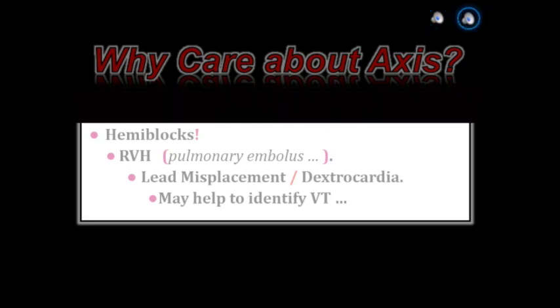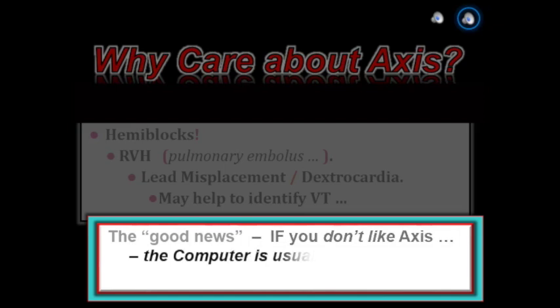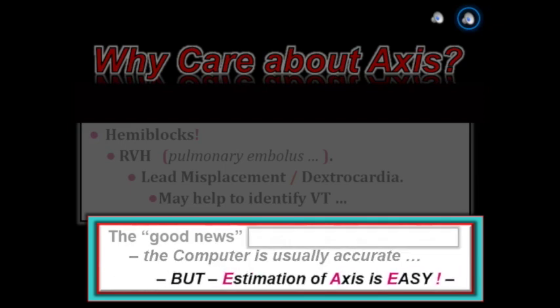The good news is that if determining the axis is among your least favorite things to do, the computerized report is usually very accurate in its calculation of axis. That said, accurate estimation of axis is easy and can be readily accomplished in less than five seconds, as we'll see in a moment.